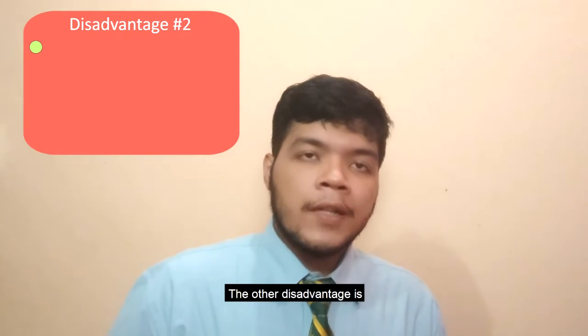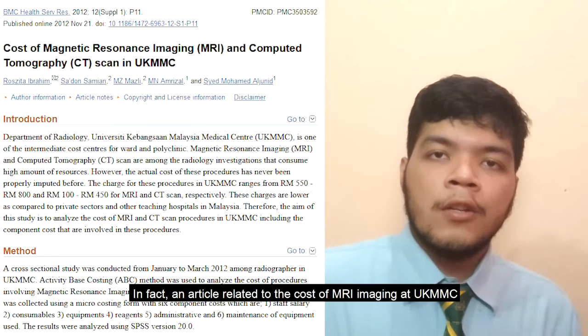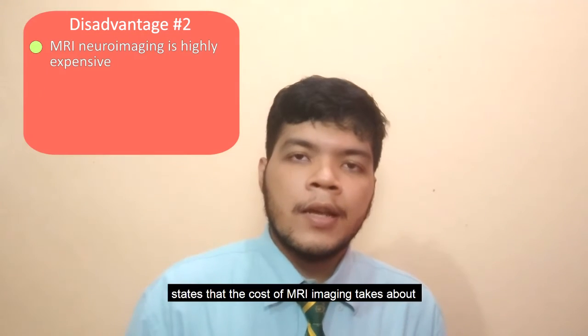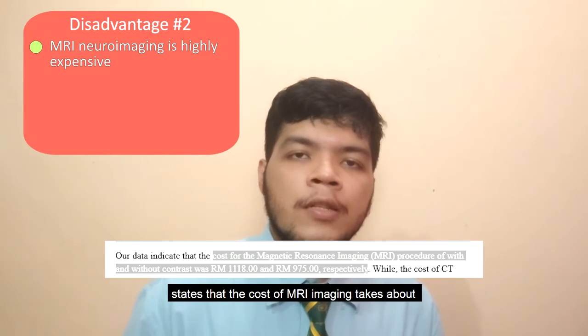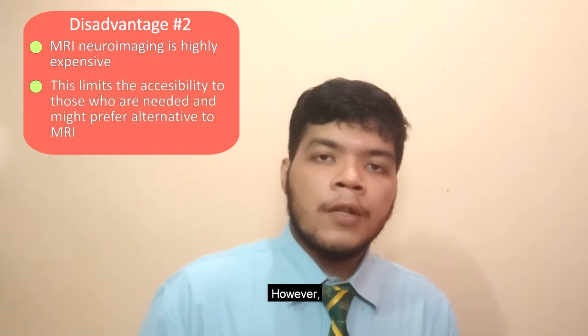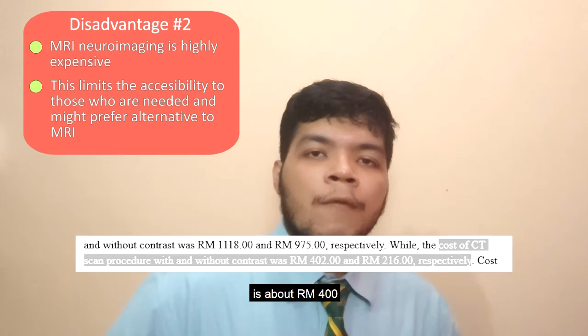The other disadvantage is MRI imaging is highly expensive. In fact, an article related to the cost of MRI imaging at UKMCMC states that the cost of MRI imaging takes about 1,200 ringgit with contrast. However, the cost of a CT scan with contrast is about 400 ringgit.